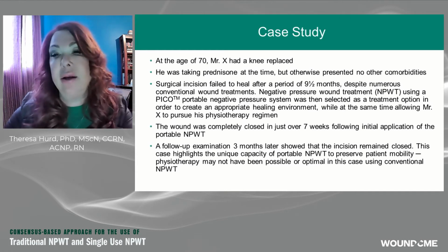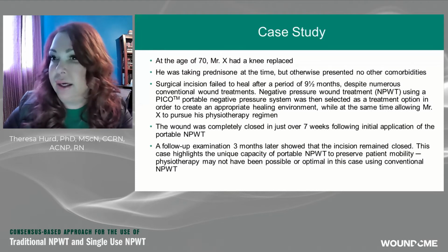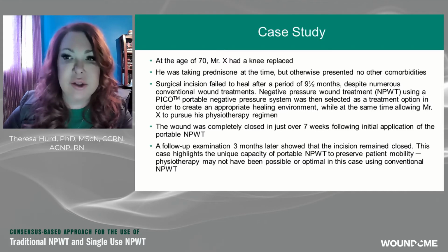What we had after we applied negative pressure was we had it healed and completely closed in 7 weeks. So think of the cost to that as well. Here's what we found out. 3 months later, we wanted to look, and we still had the incision closed. So we can say he healed. We, of course, discharged him. But here came the decision.